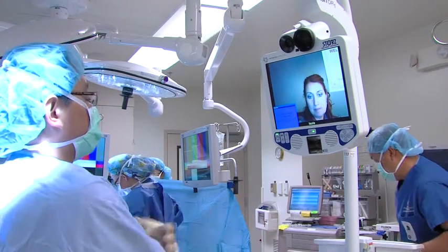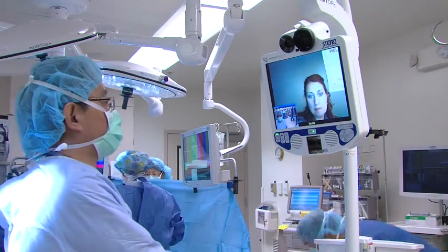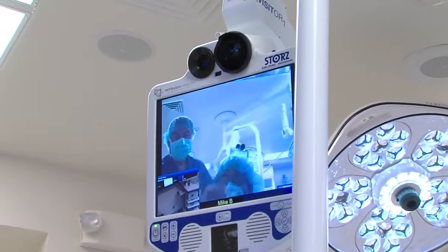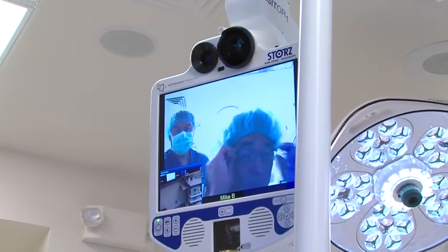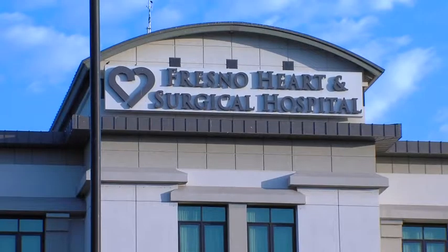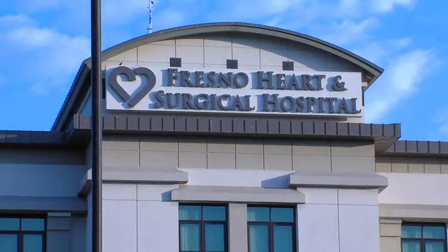Dr. Kelvin Higa doesn't have to travel around the world anymore to teach his advanced bariatric procedure to physicians. A new robotic camera gives his students across the country a whole new look, all without Dr. Higa stepping out of the OR at Fresno Heart and Surgical Hospital in Fresno.